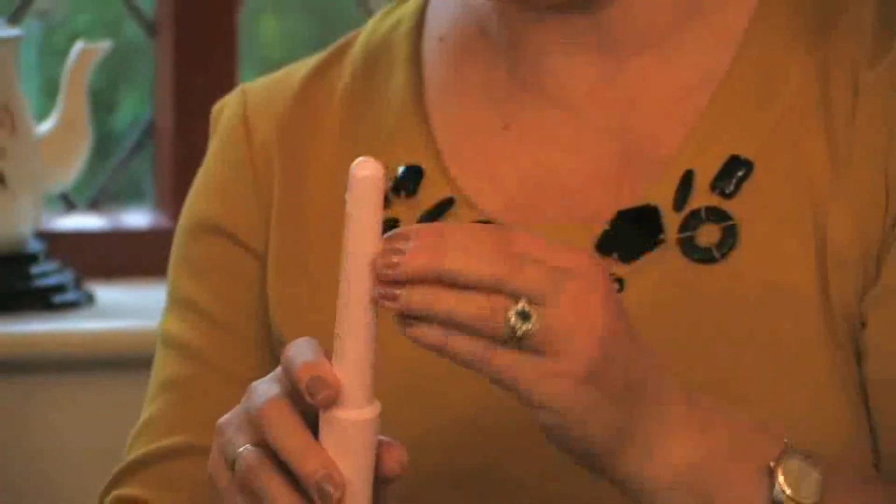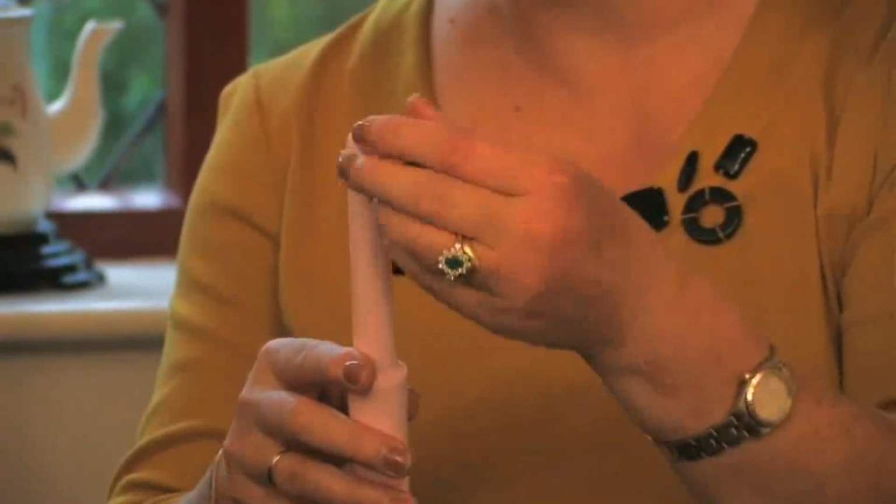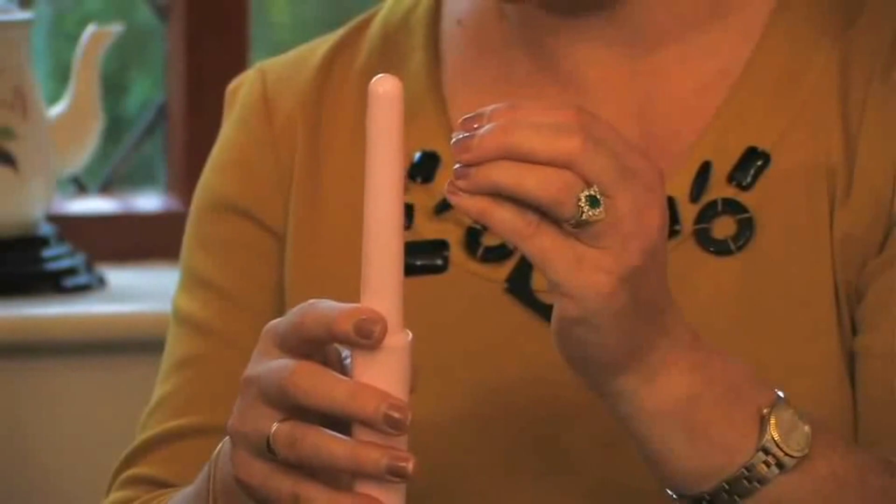When a woman starts to use a trainer, it's important that she uses plenty of lubricant. The lubricant I like to suggest is a thicker, very aqueous, water-based one rather than a thinner one. She takes the lubricant and puts it all over the outside of the trainer. The first trainer she's chosen is the smallest one.